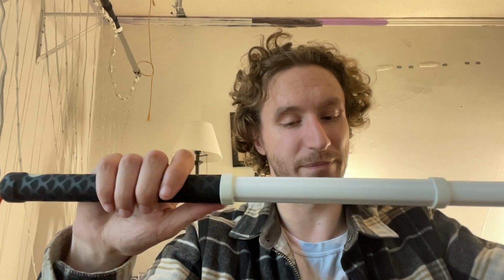For example, the Ambutech cane is heavier, but it has a better wearing tip and the customization for color, whereas this new cane is a lot lighter, has a unique design, has the anti-collapse feature, but may not be the best for outdoor travel, but also has replacement tips. So there's pros, there's cons, there's layers to everything, and when it comes to the blind community, we need to be able to make informed decisions about things, and I'm really passionate about that.